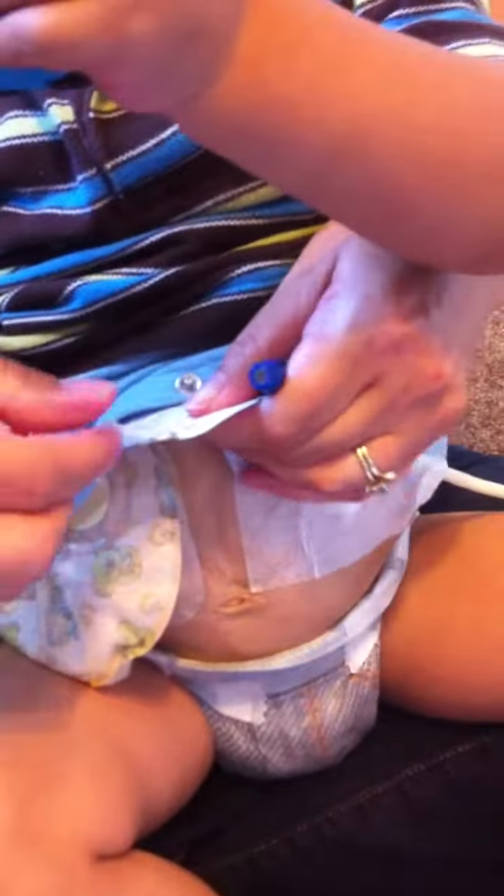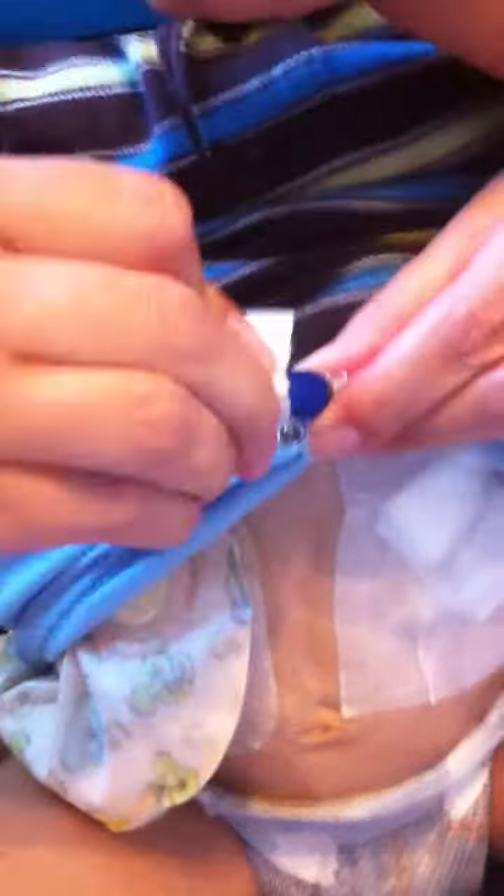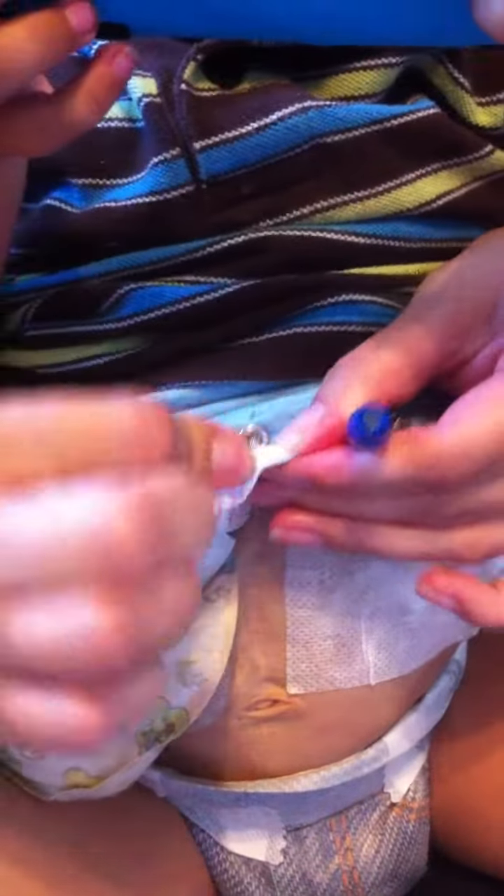Now we use three alcohol wipes when we first hook him up. Don't be afraid to use too many alcohol wipes, we've got a lot.